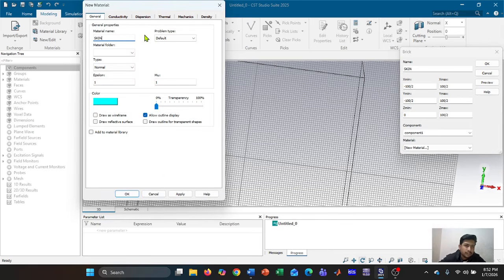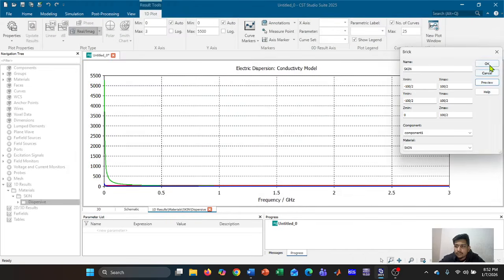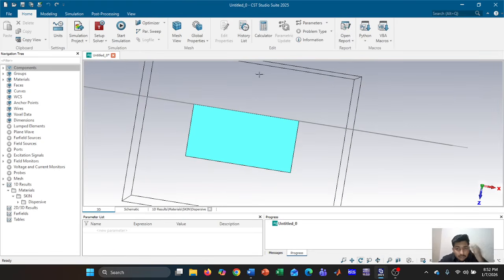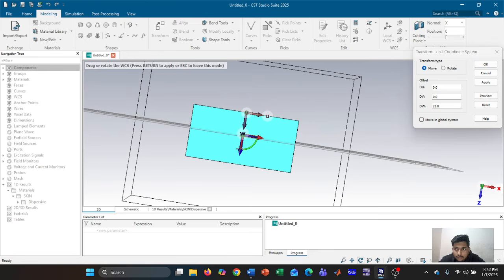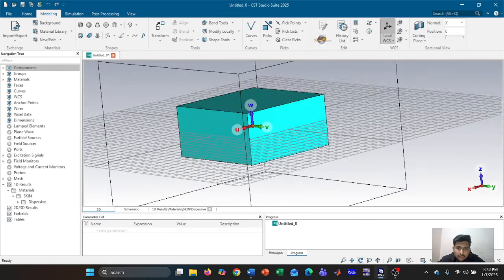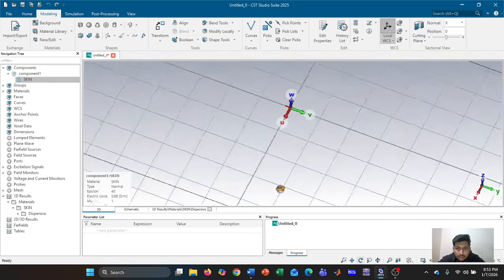So let's make the skin material. The epsilon for the skin is 40 and the conductivity is 0.88. Apply. Okay, it's a preview. So this is our skin material. I am going to design the antenna inside the skin here. So let me fit the local WCS in the middle. Let me align this. 25 would be the middle. Okay, so inside this skin I will make the antenna. I can hide the skin material, so it will be easier to design the patch antenna.